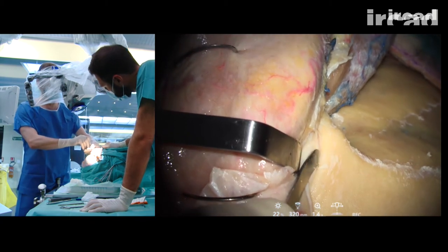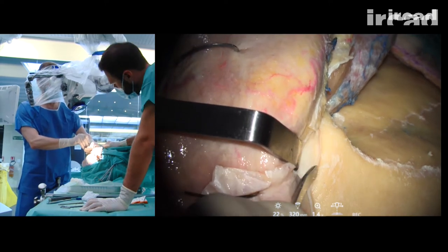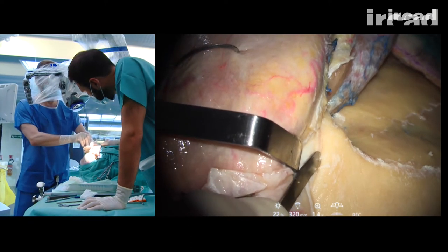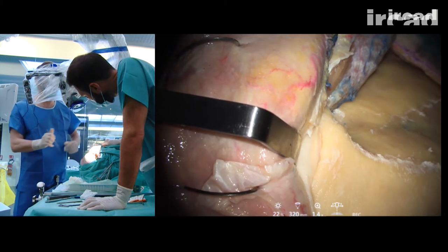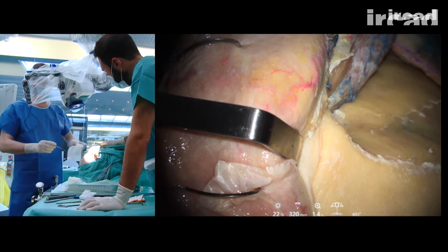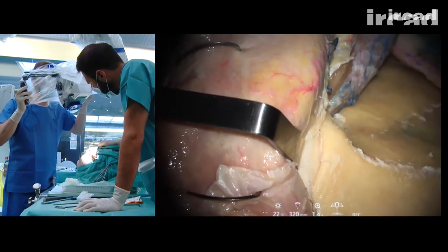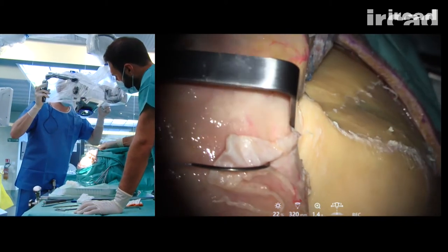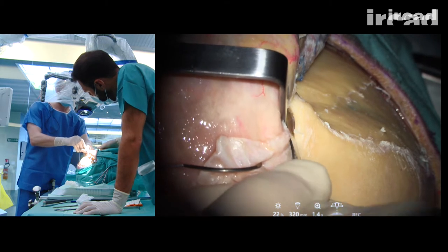You really want to keep the periorbita intact. And for this, you take a little bit of time. It's a very important step, because if you miss this step, you will have the periorbita in your way, the fat of the orbit in your way constantly.